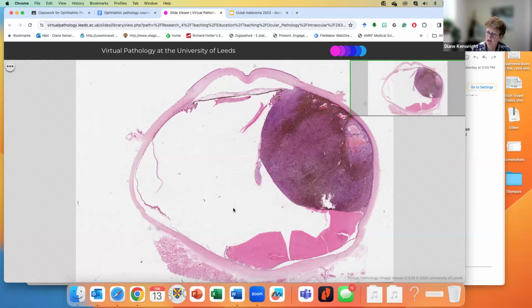Yeah, thanks. Would you be able to just show what the nerve looks like, those nerve cells in the sclera, please? I didn't see any on this with my group. Did anyone else? No, I guess I would be looking through the canals, but I didn't see any either. It's a pretty rare type of invasion, I must say. We'll Google it for you.